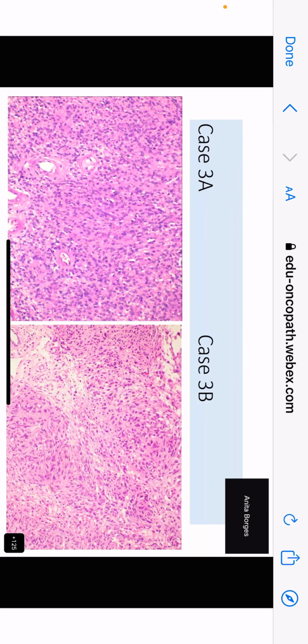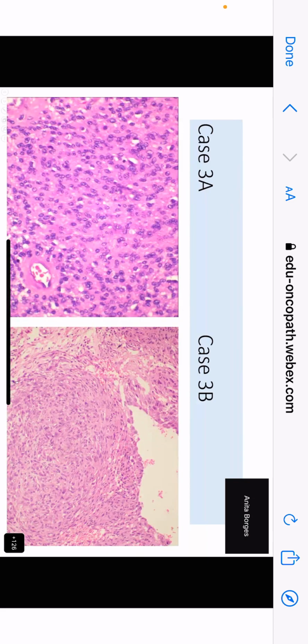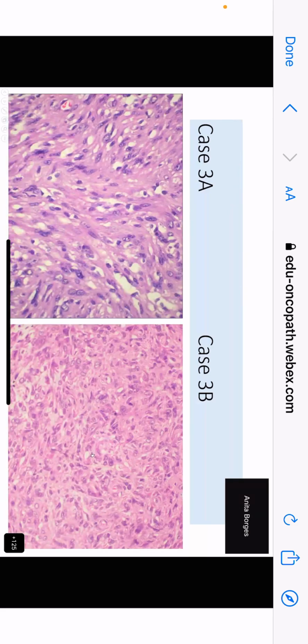Quite a number of them are spindle cells, but some of them are not spindle because their nuclei have taken many different shapes. Some are round, those may be fascicles that are cut, but the others are not like that. See again this nodularity that you are seeing? Here there is monotony. On the other side, that is not monotonous. And then you look at it at high power. And now you can see these nuclei on both sides very, very close.